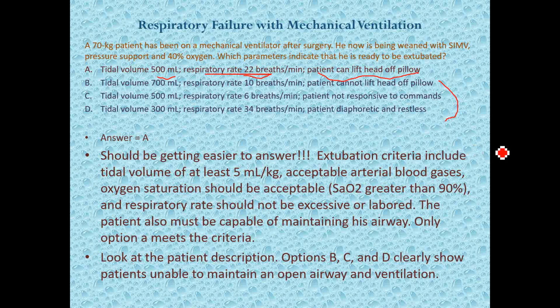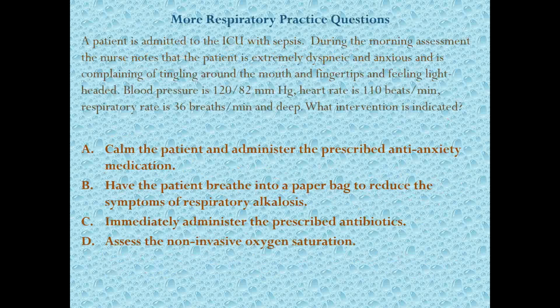Now, I do have here that the tidal volume should be 5 mils per kilogram, and that's for those inquiring minds. That is not something you're going to be tested on or that you need to know. But it's a guideline that physicians will use that says, hey, if you can pull a big enough tidal volume, then you're ready to be extubated.